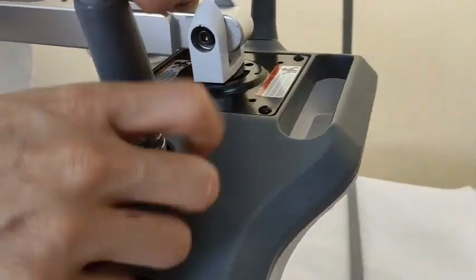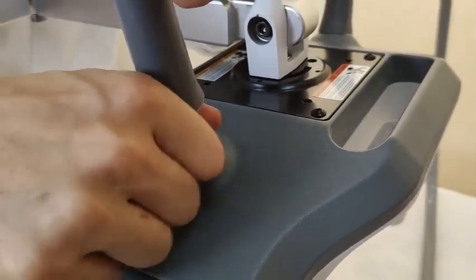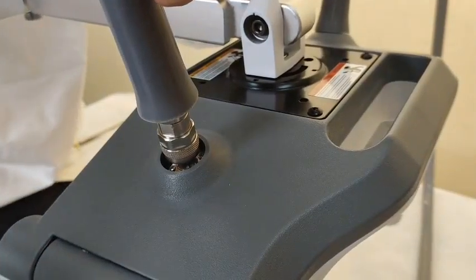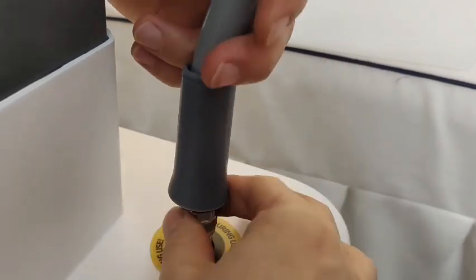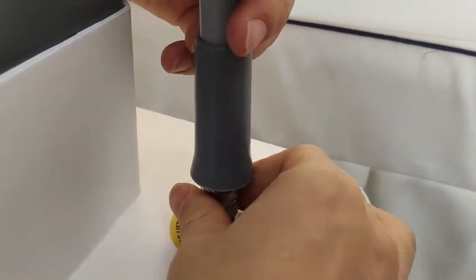Next step, we will put the tube which connects to the paddle and the machine. We need to match the hole and then tie it. The same operation with the other tube — just put this tube on the machine and then tie it.